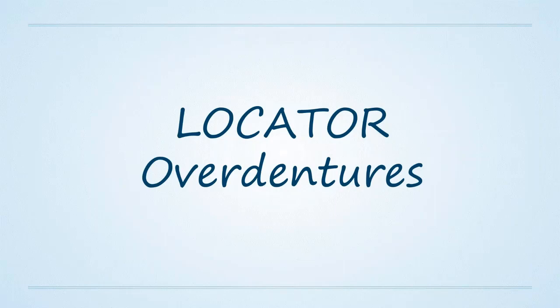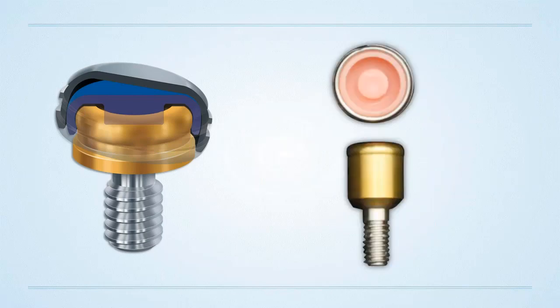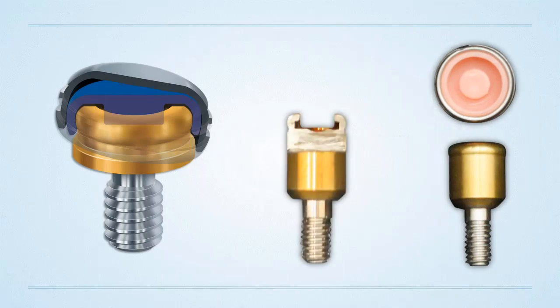First, let's go ahead and talk a little bit more about how we work with our actual housings and attachment systems. And the implants, once they're integrated, they're really pretty straightforward to work with. The key is, what are we doing with the stuff on top? For my clinical practice, I've found a lot of success using the Locator abutment. The Locator abutment is essentially like a button that snaps onto a jacket. And many of us are familiar with the Locator abutment and how it snaps together.